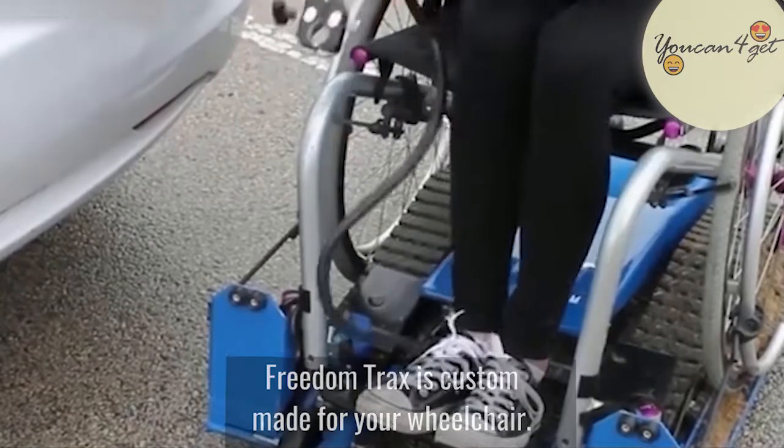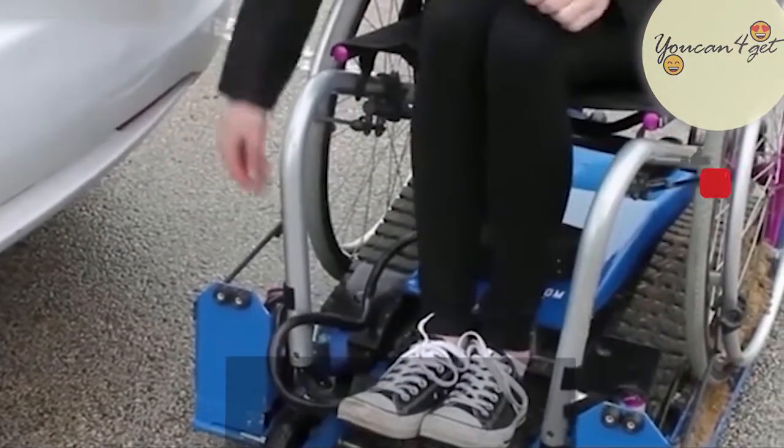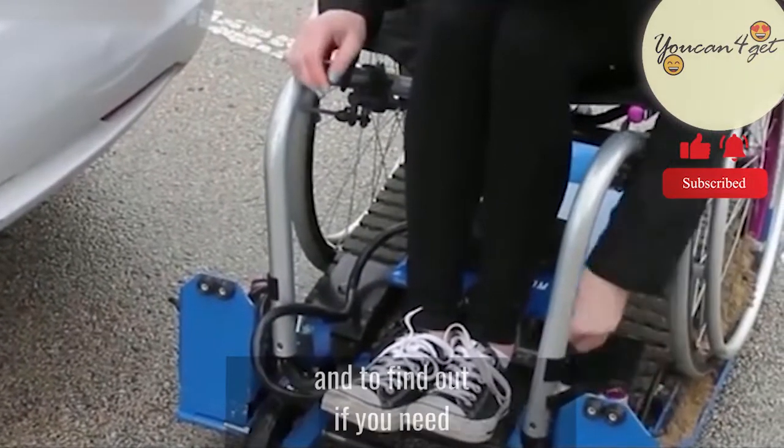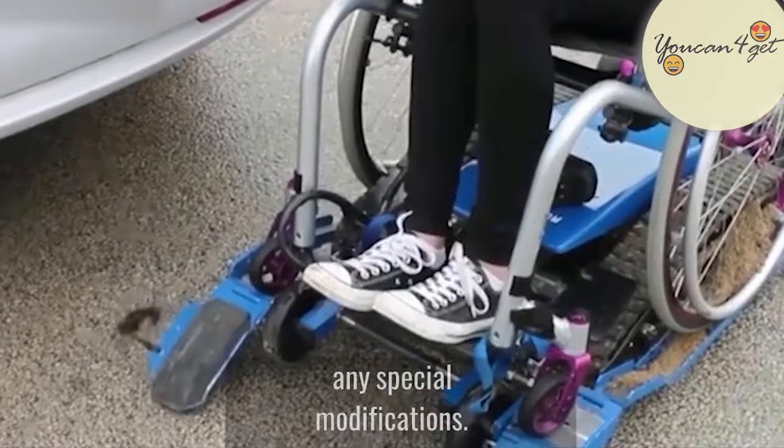Freedom Tracks is custom-made for your wheelchair. Once you purchase it, someone gets in touch to get general measurements and to find out if you need any special modifications.